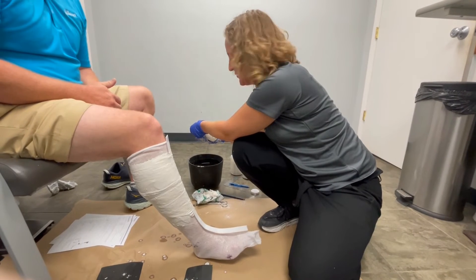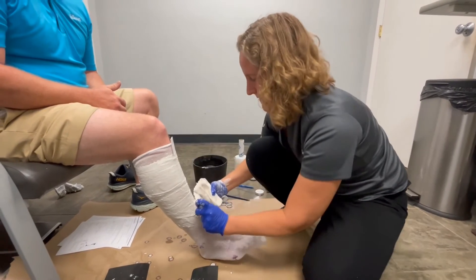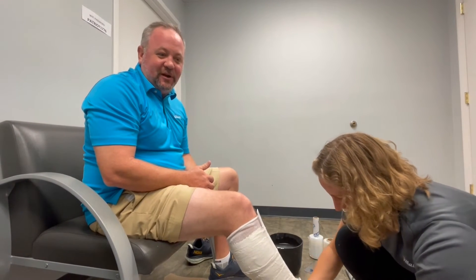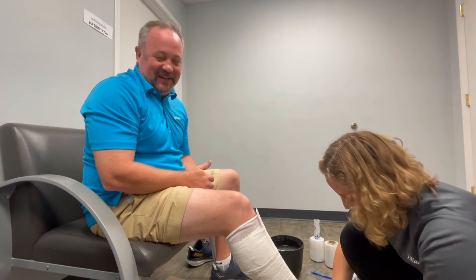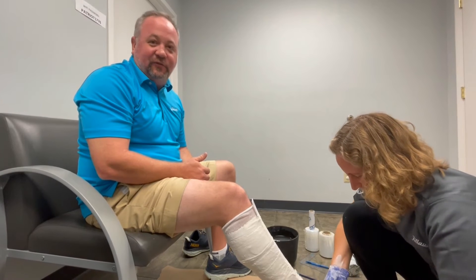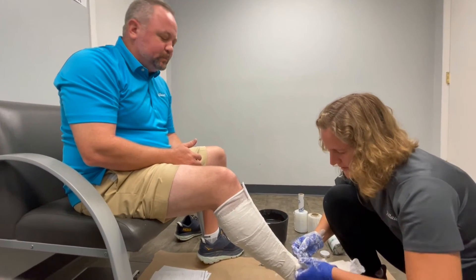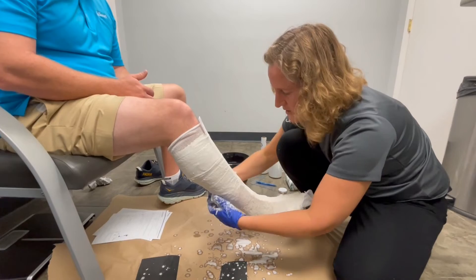I'm going to use plaster for the casting. You can use synthetic cast tape if needed — just make sure to use enough so it's nice and thick and bonds well together. We don't want flimsy casts; they don't make good AFOs. Make sure when you're sending these in that they're at least four layers of plaster, or two to three layers of cast tape. If you get a cast that's too thin when you remove it, please reinforce it — that's also an option.